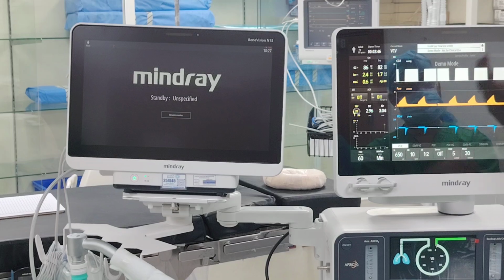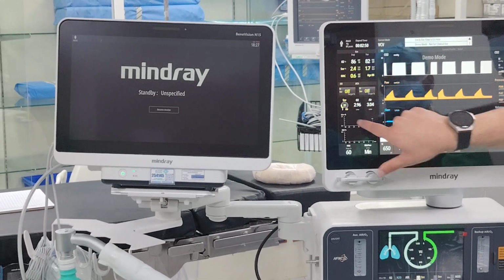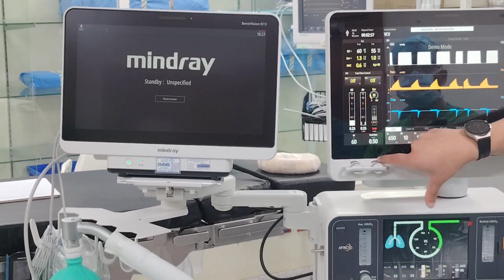If you feel uncomfortable, you want to go to the old way, you can, look, click here, go to total flow. Total flow is, press check, is what you are used to.